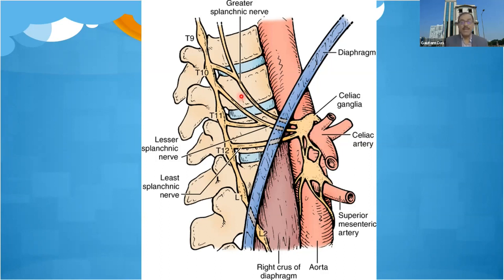So if you're doing the splanchnic nerve block, the splanchnic nerve is much more compact. Again, it is a schematic diagram, so it's not perfect. The splanchnic nerve is a much more compact, smaller area. What is the advantage and disadvantage? This is a large area. Its size varies from 2.5 centimeters to 5 centimeters. So it is a large plexus. What is the advantage? If we are putting the needle somewhere, the failure rate chance is less because it is a large area. And if you are giving a larger volume, it will be covering nicely.